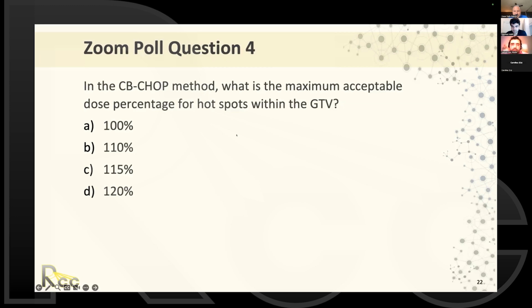So I have one question for the IMRT and VMAT. Do you have any recommendation for the conformity index and the homogeneity index? For head and neck, it's complicated to give a recommendation because the targets are very irregular, and the dose distributions also follow the irregularity of the PTV.